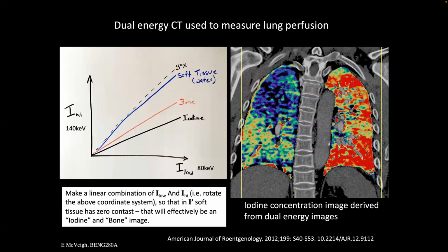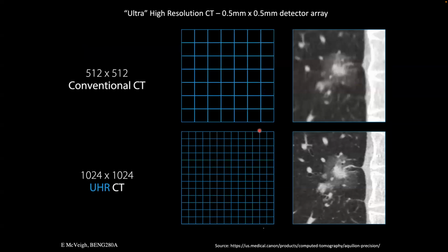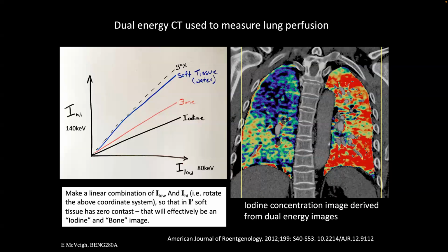right? So we've been using this actually quite a bit in patients who come in with lung disease, or there's a disease that is treated a lot here at UCSD called CTEPH, which every CTEPH patient, before they have their surgery, gets one of these pictures, essentially to see where the reduction in blood flow is severe.